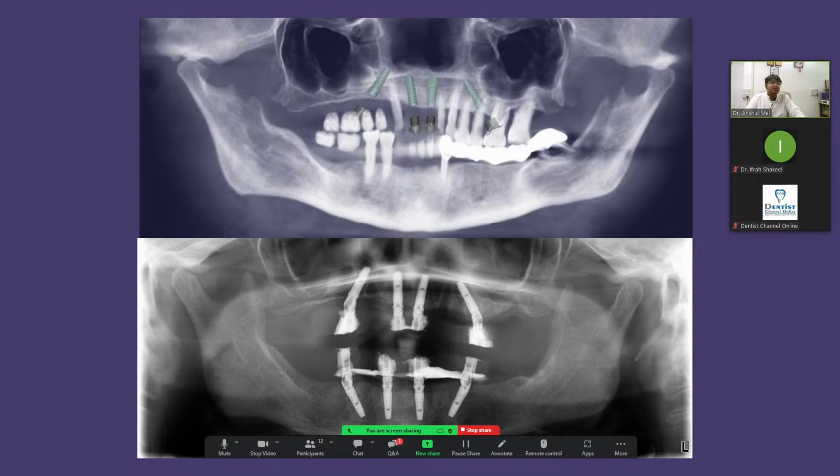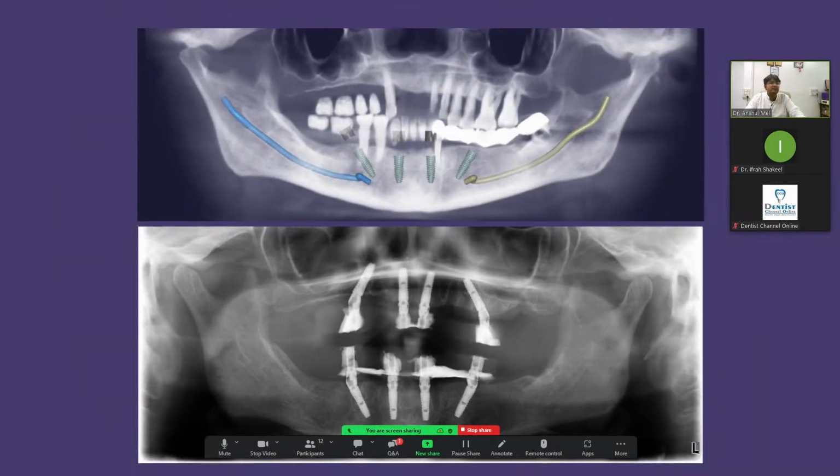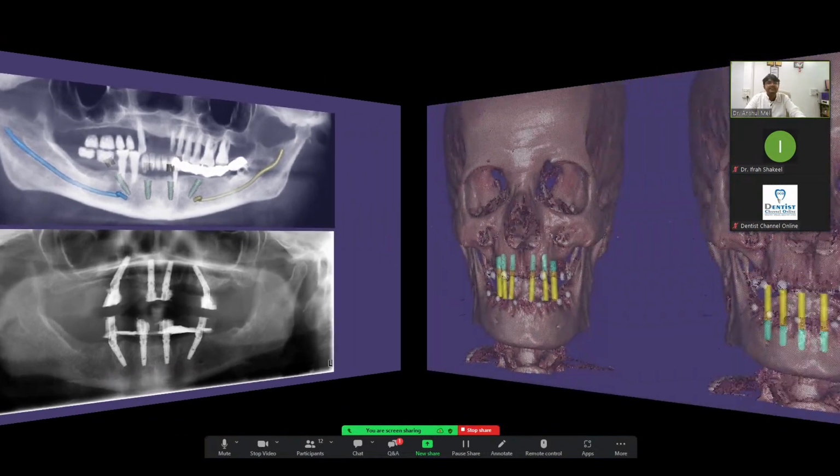So there is no pressure to take an impression or jaw relation, everything. The patient has also undergone surgery and a lot of trauma, so it's not giving a perfect jaw relation. There is nothing to worry about, and you will get perfection in your prosthetic part. So this is what we have planned and what we are watching for the case.